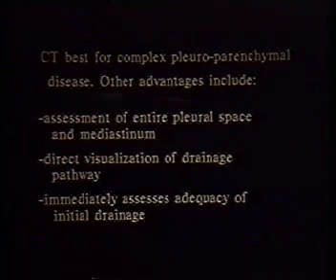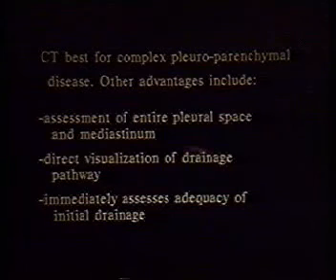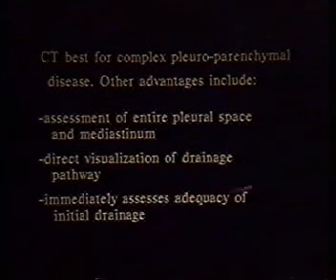The other advantages are that it provides a visualization of the entire pleural space, which is important if we're going to try and eradicate any pockets of fluid which may not be obvious from chest radiography or from ultrasound. It also provides a direct visualization of the pathway that our drainage catheter is going to take, and this is important if we are to avoid transgressing very vital structures and vascular structures.